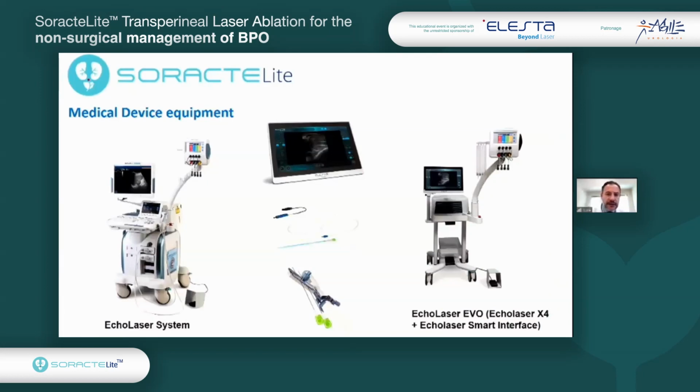And this is the device that we have. This is the brand new machine that we use, which has an integrated ultrasound machine. And this is the software for planning the fiber positioning.